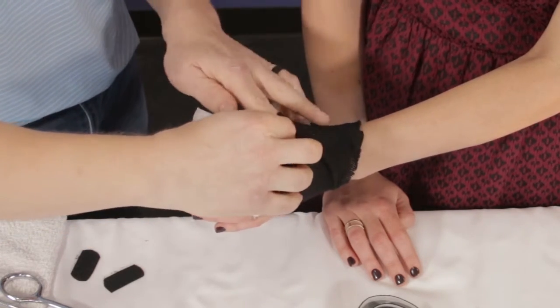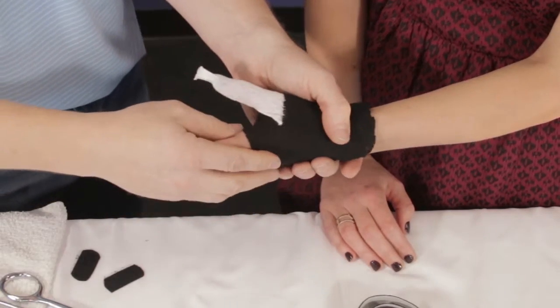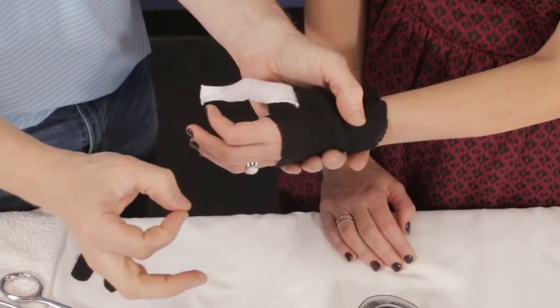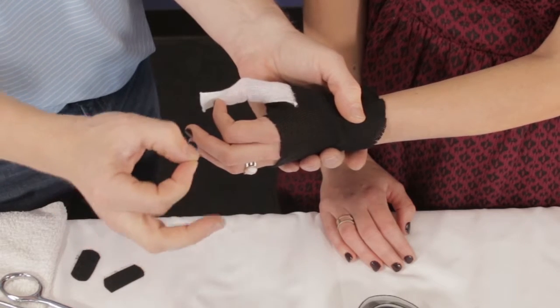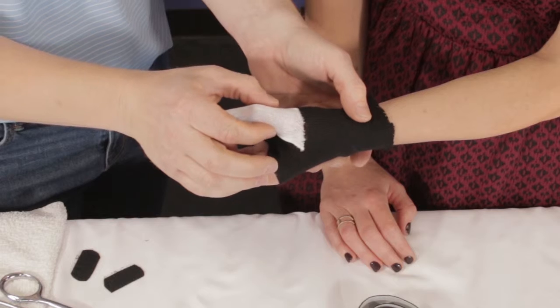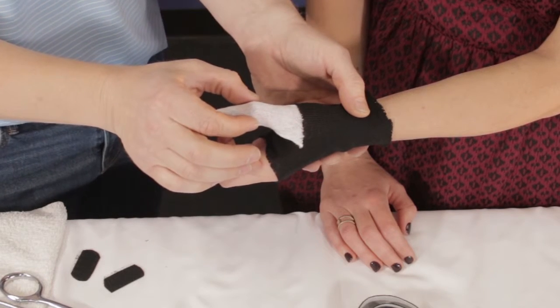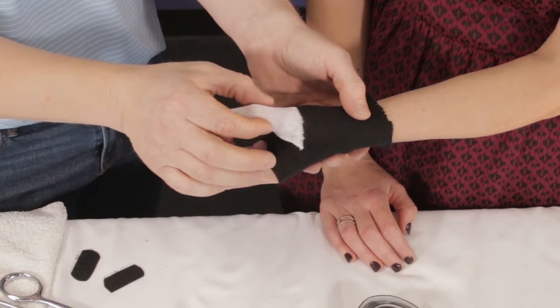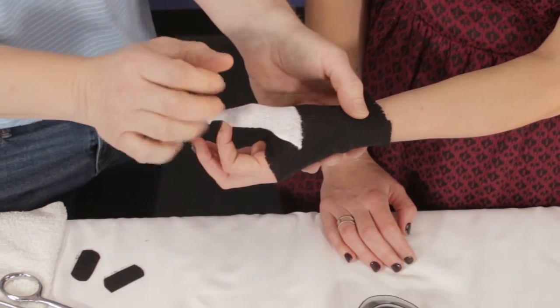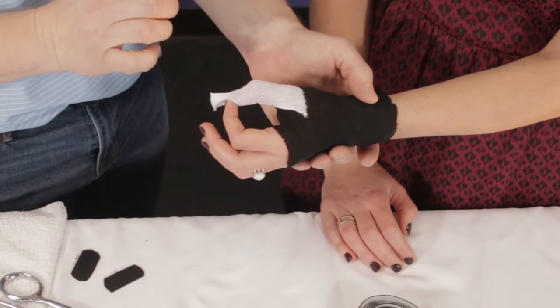I'll use the stockinette to keep those tags down pretty well. I'm going to ask her to make a gentle tip-to-tip touch, and make sure she understands what I'll be asking of her later. I also have a little spacer here so it's less likely to get stuck on her IP joint when coming off. We can always untag and reseat this if we need to, but that helps make sure that's not likely to happen.